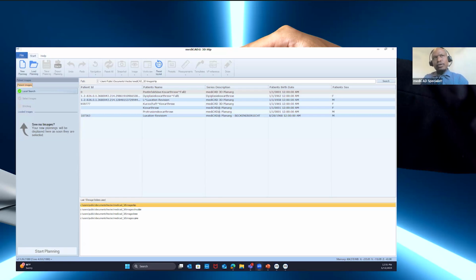It doesn't work with DICOM MRI, because the software is focused on planning, and MRI basically focuses on ligaments and other things. But CT is mainly the bones, which is basically what's needed for templating. So that's our focus, and that's why CT is mainly what is compatible with it. I added my contact information, my email and phone number, so you can save that. You can email me personally, and then in a private chat, I'll be able to save that information.